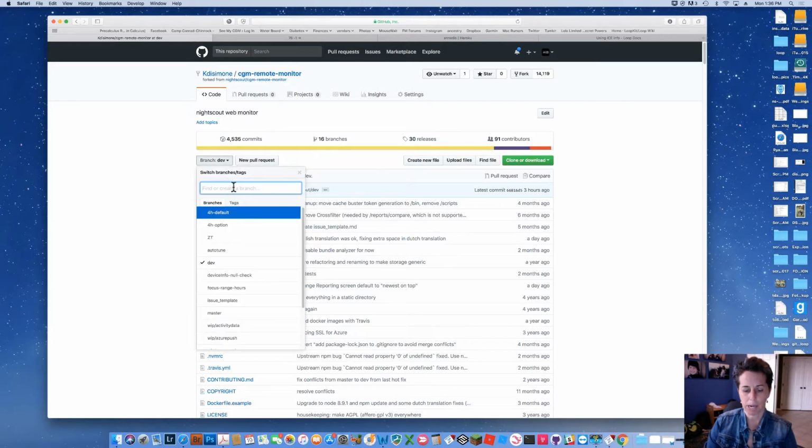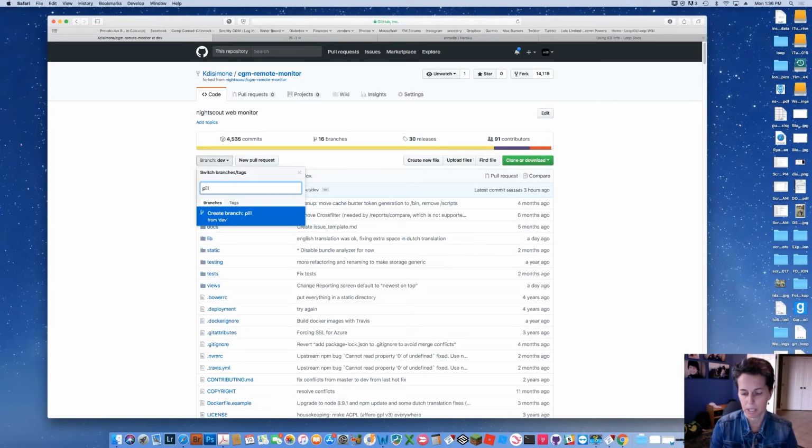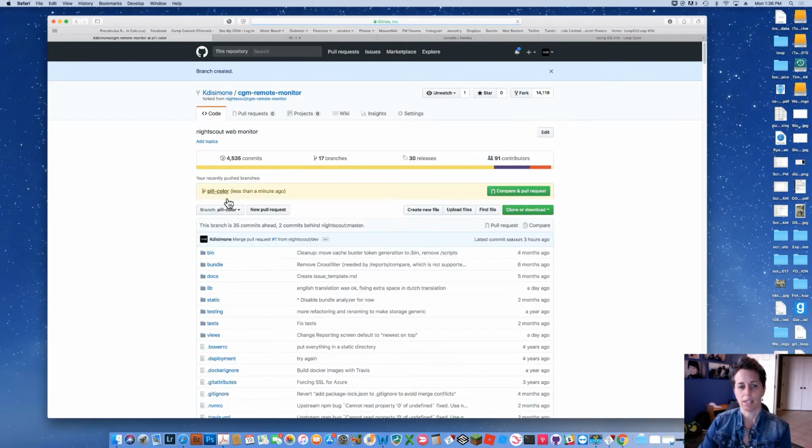And I'm going to create a branch and I'm going to call it pill color, for example. And basically, I'm creating a brand new copy of the dev branch. You can see that right here it says it's creating a branch called pill color from dev branch. So basically, it's taking my dev cookbook, it's exactly copying it, but renaming it pill color. So I have both of them existing side by side. So I'm going to do that. And I just created pill color. So I have a new version of the cookbook based on the dev branch. They're exactly the same right now.